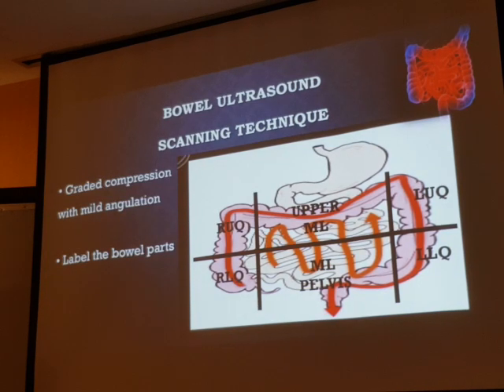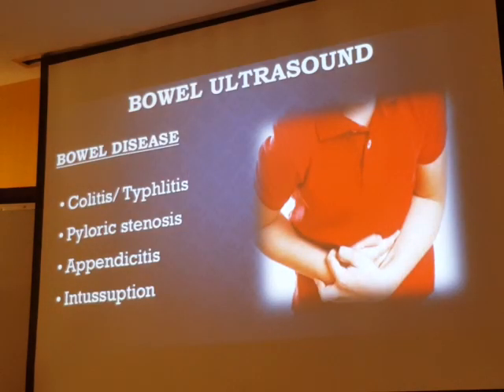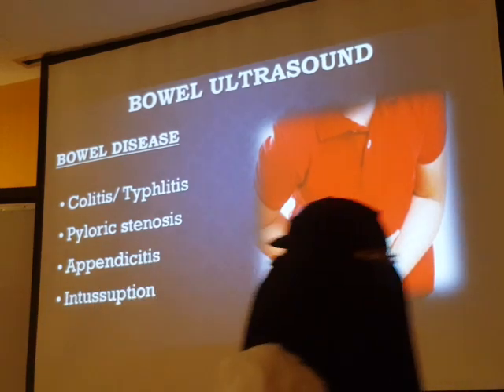Also, you document this for the radiologist with 6 images. So 6 per curvilinear and 6 per linear, so this is what? 12 images, if it is normal. If it's abnormal, of course, we have to take more images. While you are examining, you have to label 3 anatomy: the appendix, which is very important and a very stat case, and the ileocecal valve. So we label right upper quadrant, left upper quadrant, and the appendix and the ileocecal valve. This is the scanning technique and how we provide a good scan with the full information. Any questions so far?